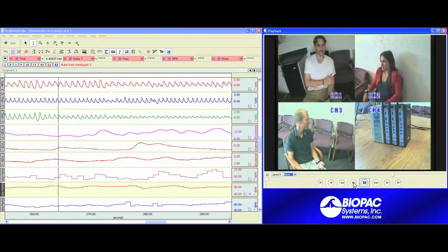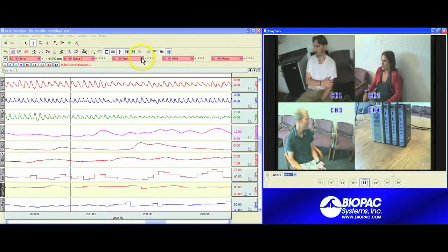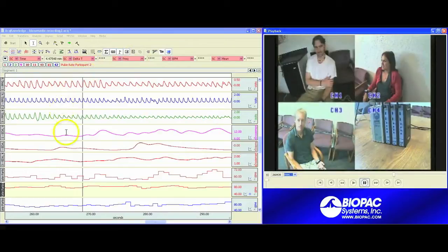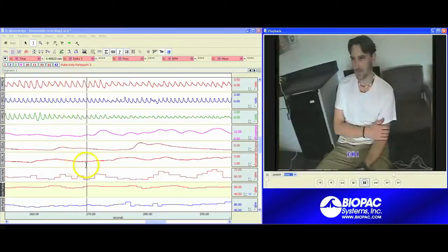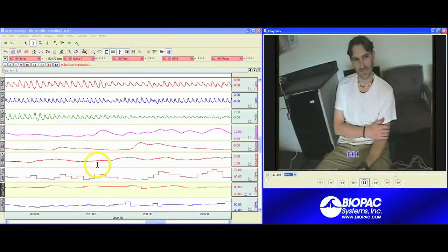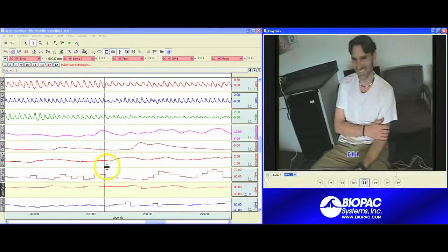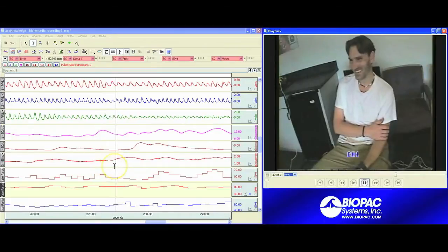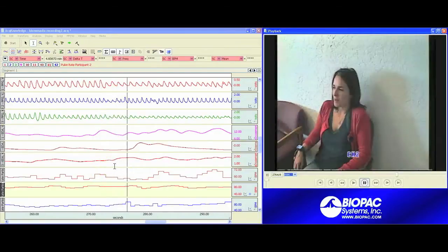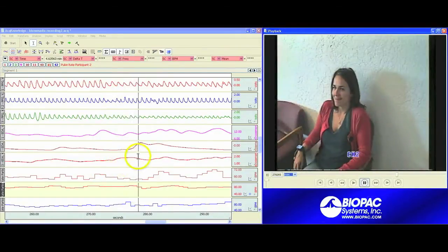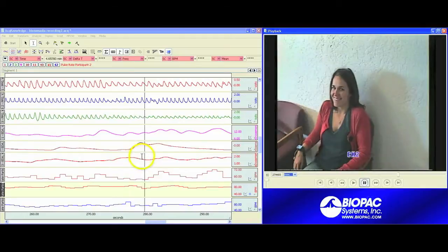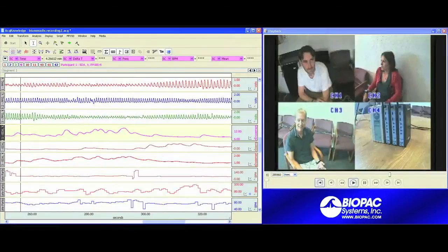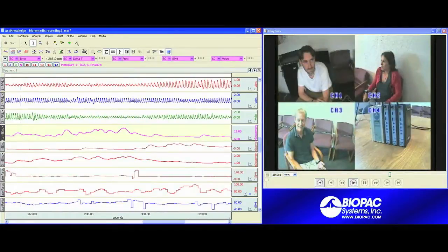What you'll also see is on the left-hand side where our data is located, you'll see this I-beam cursor scrolling through the data in time with the video. So as we're going through the video, the I-beam cursor is going through the corresponding data points in our physiology data.